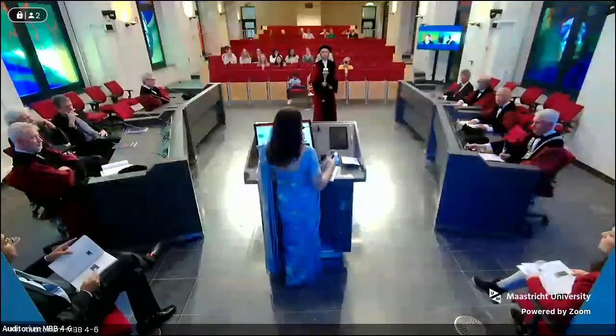No, that's true. You have time to answer the question. Thank you. So yes, there are different machines. Like for example, the AngioView does use the split spectrum decorrelation algorithm. Then you have amplitude and phase difference signals which are used. So there can be some machines which use a difference in amplitude between the B scans and then get the calculation. And there are some which use phase. So you cannot compare, it's like comparing apples and oranges, actually. You cannot compare the scans from one machine to the scans of another machine. So yes, as of now, maybe like electrophysiology, where they formed an ISCEV international standard for the ERG reading that we get, maybe along the line, we will get some international standards for OCT angiography across machines. So as of now, it is a big challenge.